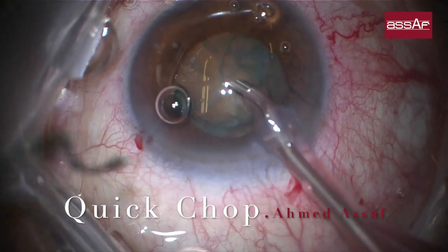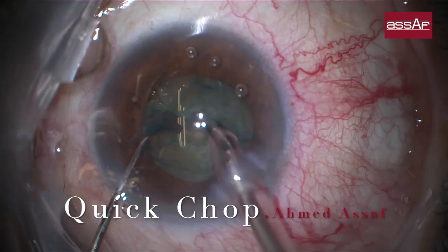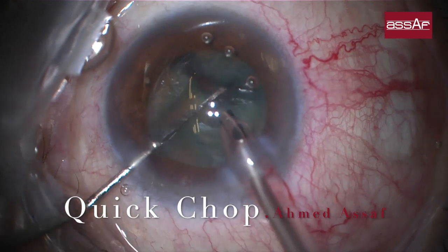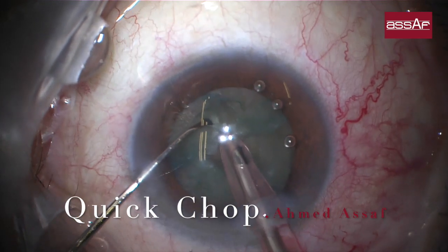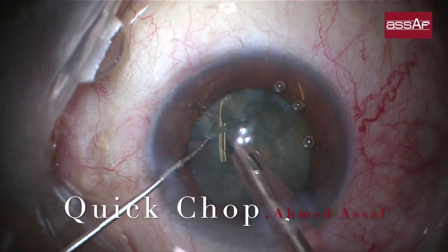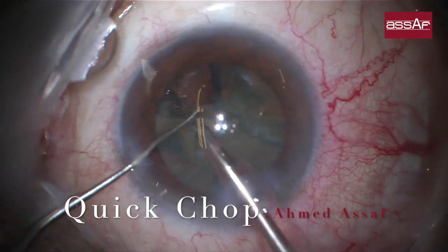The curved phaco tip is being used, and on the left side is the neu hand chopper made by Geuder — no financial interest in this product. Impale in the very center of the nucleus, then dip the chopper vertically close to the phaco tip and split the nucleus into two halves. Each half can then be divided into two quadrants, giving four quadrants total, which can be further divided into multiple pieces.